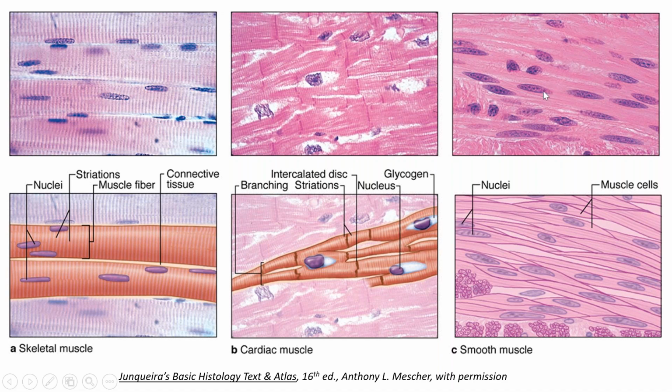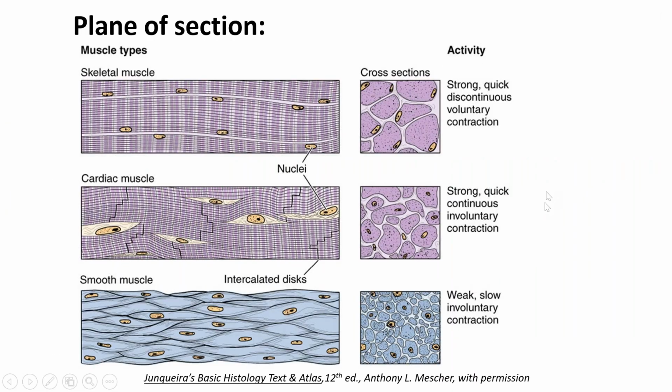The last muscle is smooth muscle. These look like little kayaks, or they say they're fusiform. So we have an oblong shape and the central nucleus. And so these cells are nicely packed together, and we can see the rendition down here. Now notice again, we're not seeing a nucleus in every cell because of plane of section.